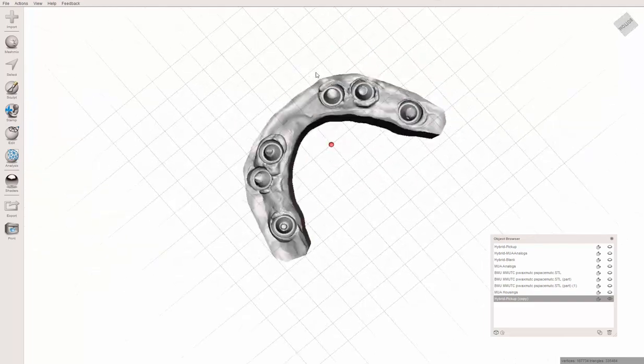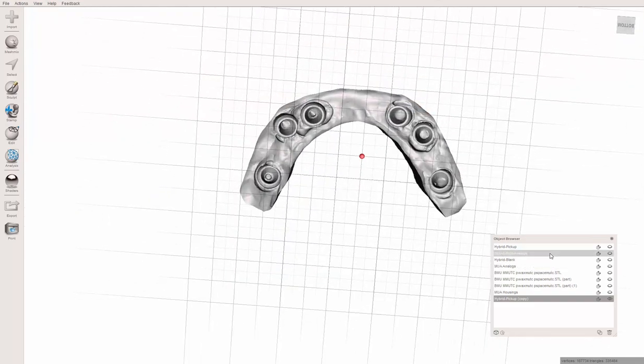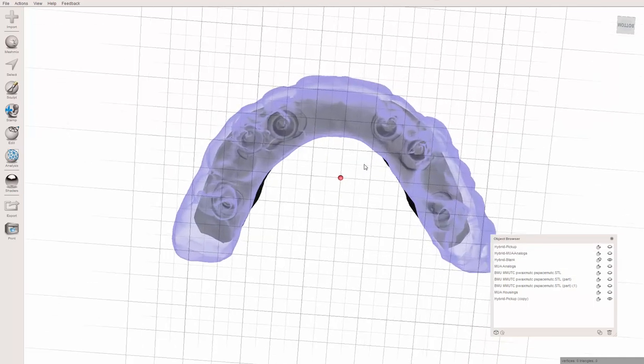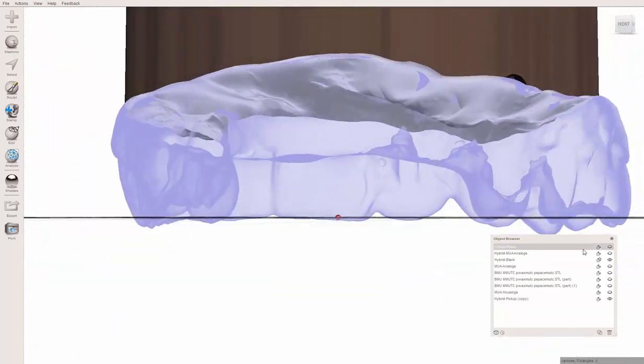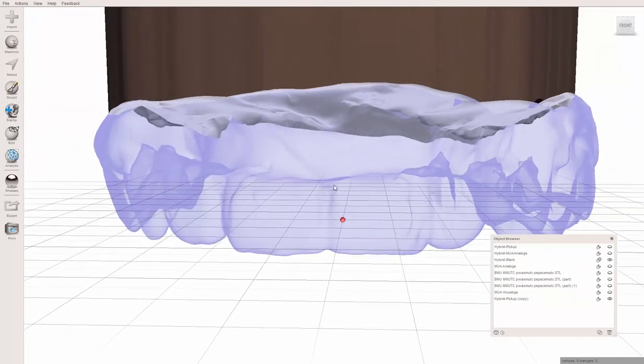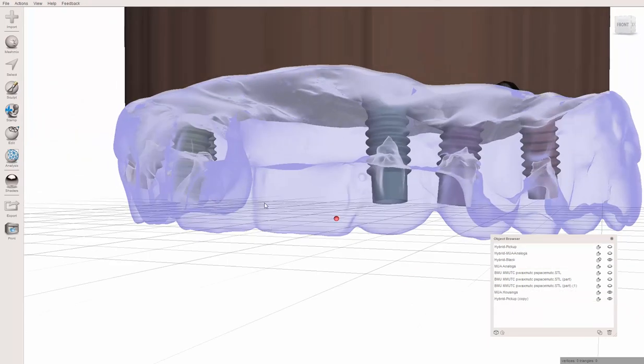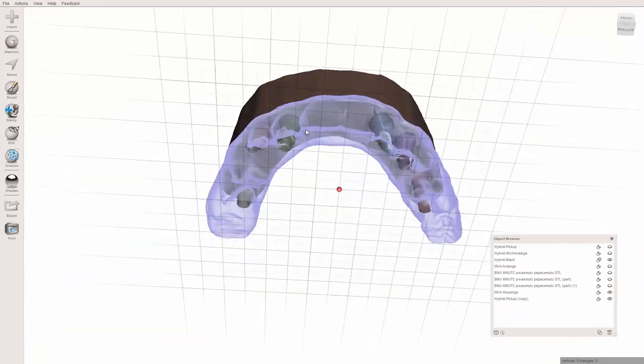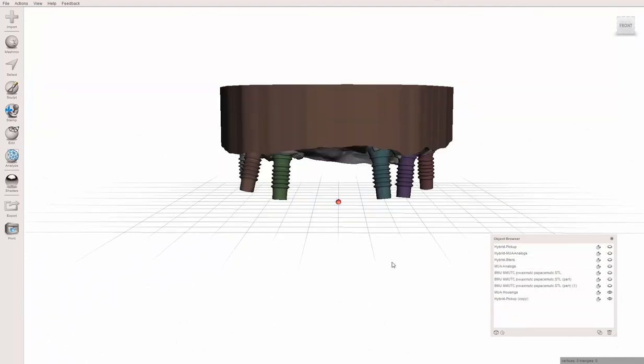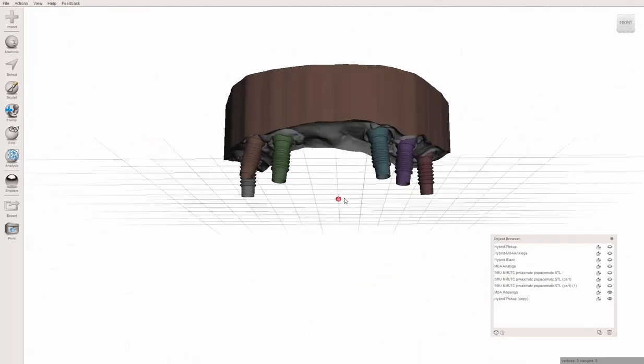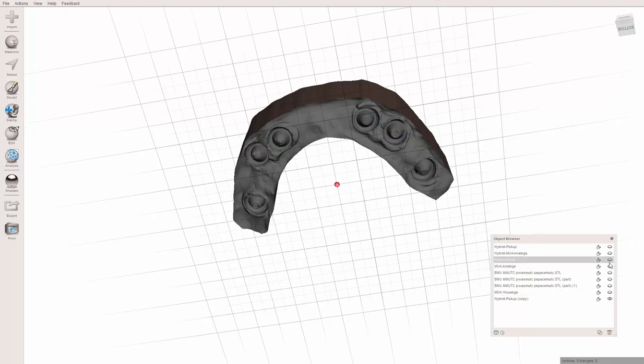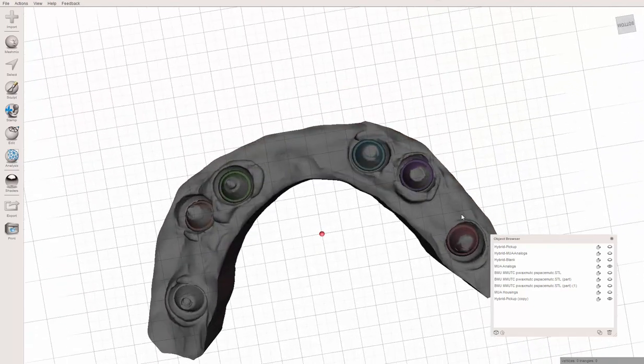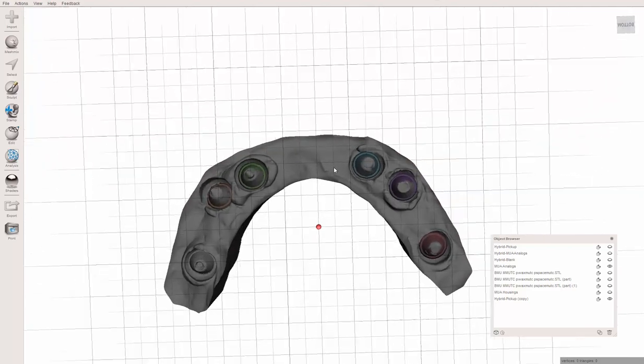D to extrude it. I'm going to say 14 millimeters, Y direction, flat end type. Hit Accept. Very important step - after it processes, hit Control A again so it's all highlighted, Edit, Flip Normals. So now you have your model. You have a model that you could print if you wanted. Or you could now take your denture that I've created, that blank I mentioned before.